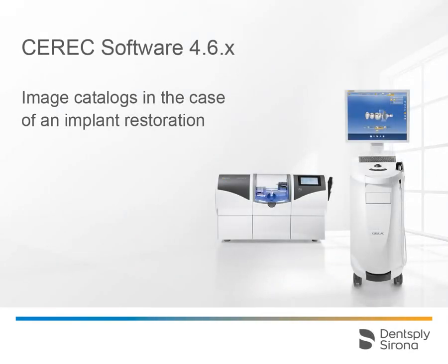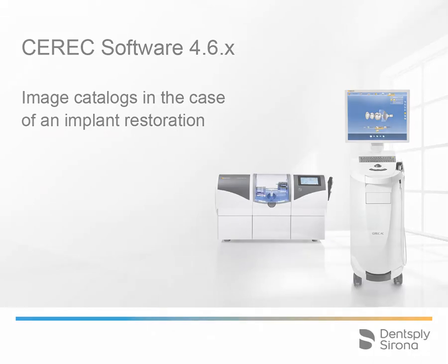Welcome to this video tutorial on the subject of image catalogs and their function in the case of an implant restoration. In this video, you will get to know the various image catalogs in the acquisition phase and will demonstrate the further process through to the model phase.